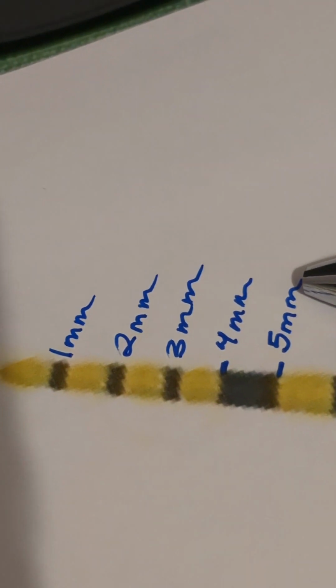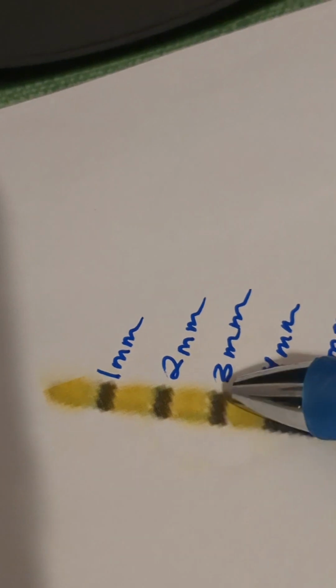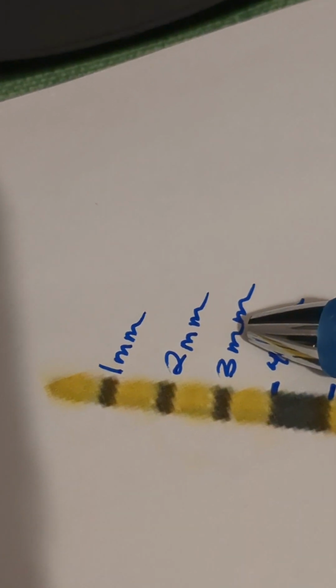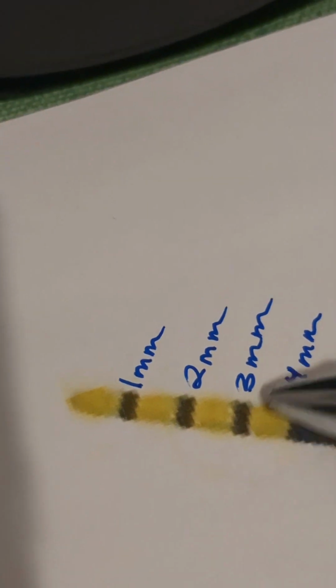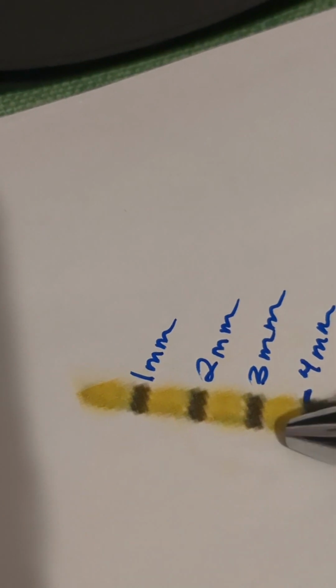So if you're probing and it stops on the black line, whatever measurement that is, whatever millimeter that is what we will write. However, if it goes above the black line into the other area past the black line, it will no longer be counted as that number millimeter. It would go to the following millimeter.